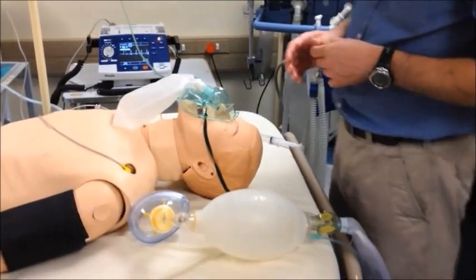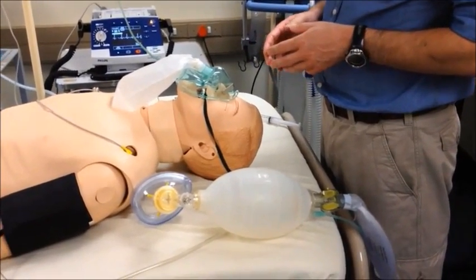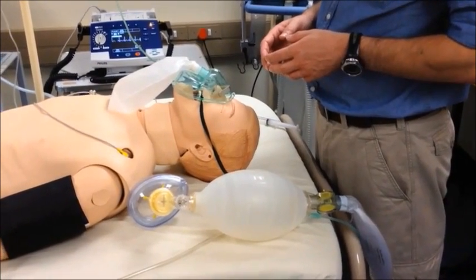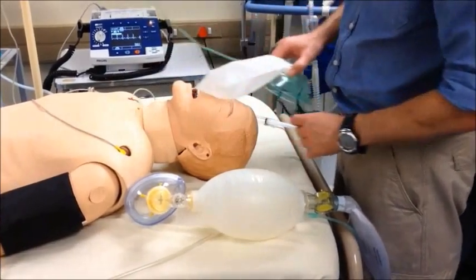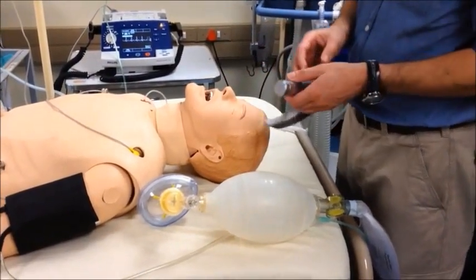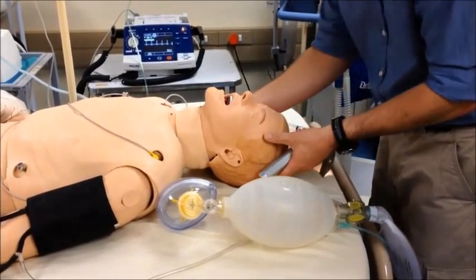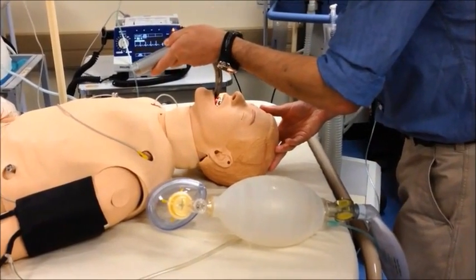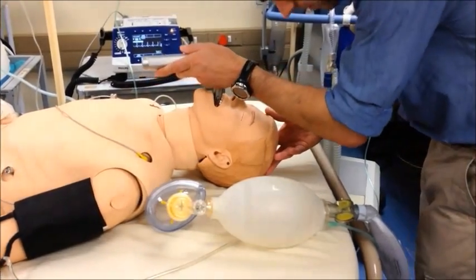Keep your oxygen source on the patient without actively breathing for them; await sedation and paralysis to be complete. Once the patient is paralyzed, remove the oxygen mask or other oxygen source from their face. Take the laryngoscope in your non-dominant hand. Position the patient gently and slide the blade of the laryngoscope into the right side of the mouth, deflecting the tongue to the left.